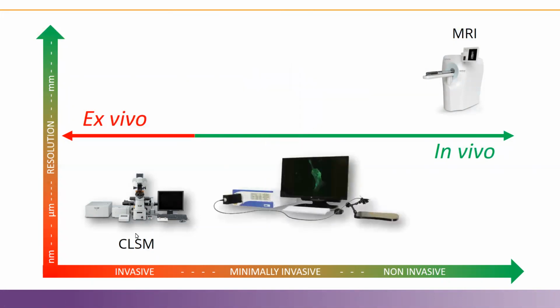So confocal laser endomicroscopy combines the best of both worlds. It is minimally invasive. That means you put a probe inside the animal and that will start capturing the images. You can perform in vivo imaging and the resolution will be similar to the benchtop microscope.